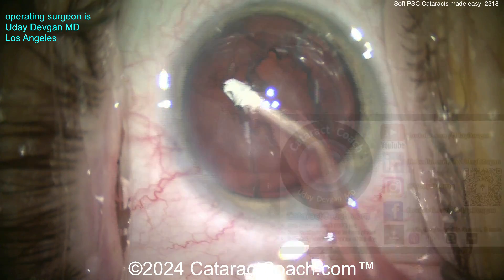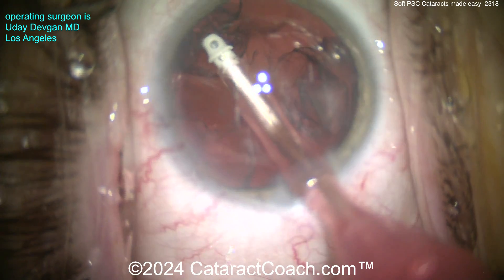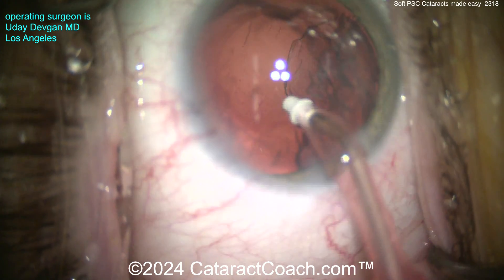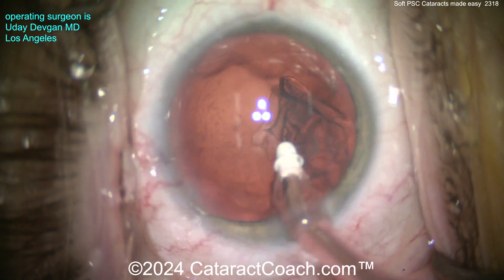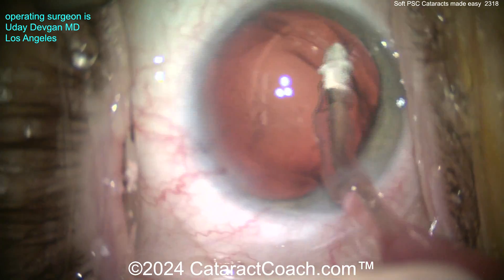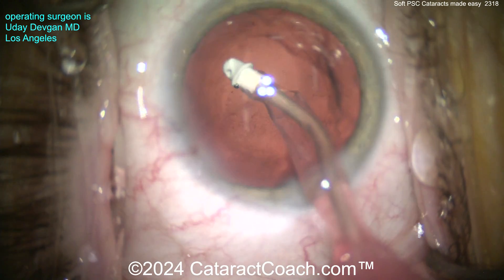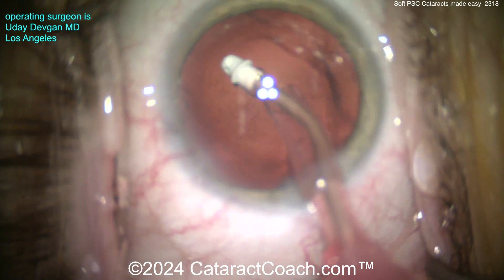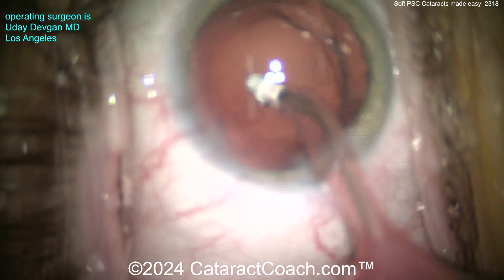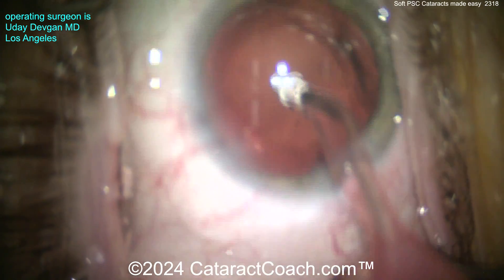Cortex removal is going to be the key. We're going to take our time here, removing the cortex using the coaxial I/A probe, just taking our time and cleaning it up. Look at the posterior capsule — a lot of stuff back there. We want to clean up as much as we can. With just a little bit of gentle vacuum, you can get almost all those opacities completely removed — nice and easy, back and forth.